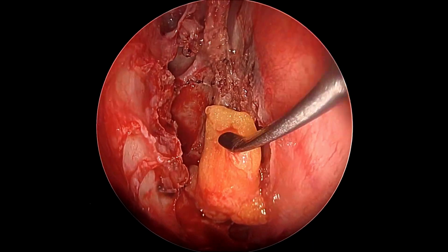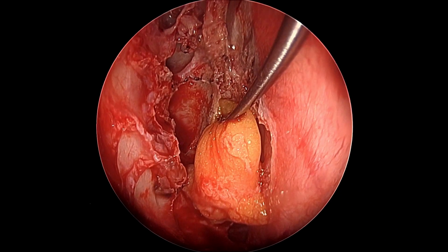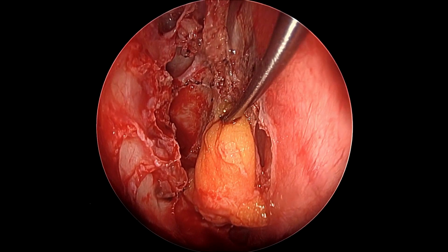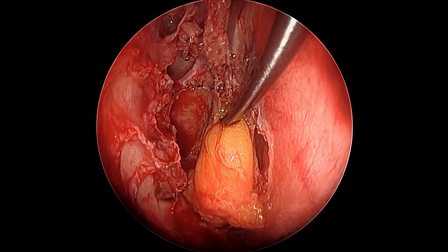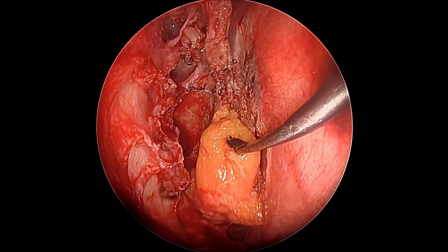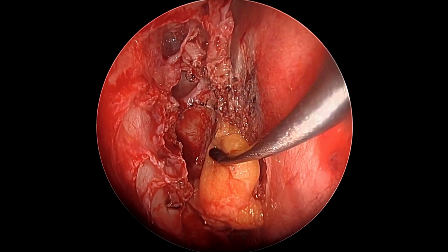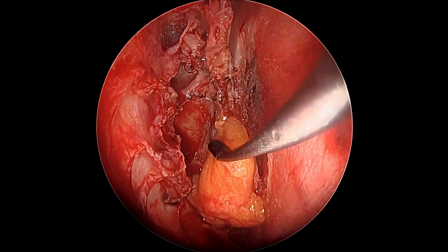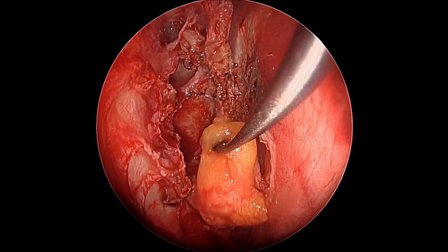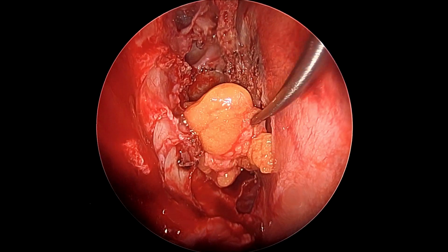So one can use one hand or two hands for it. You can have an assistant hold the endoscope, where you use two instruments and two hands to gently push the fat inside. If you're comfortable, you can do it with one hand as well. Normally we do not advocate the use of a ballpoint probe, because that always brings the fat out with it. So we always prefer to use a flattish instrument such as this. This is a double bent elevator we use for these kinds of patients, and with the 70-degree scope, it gives us a very good angulation of work.